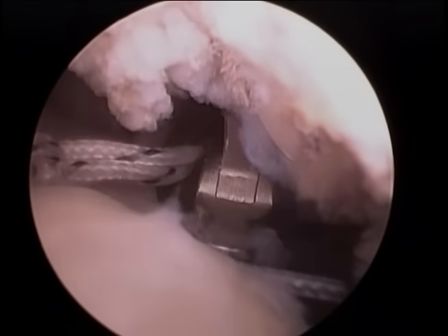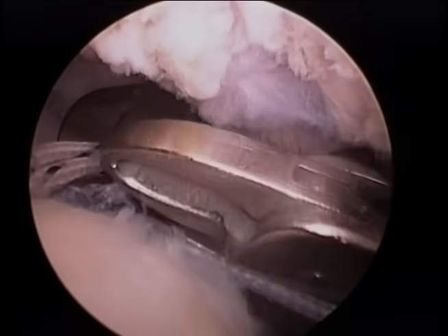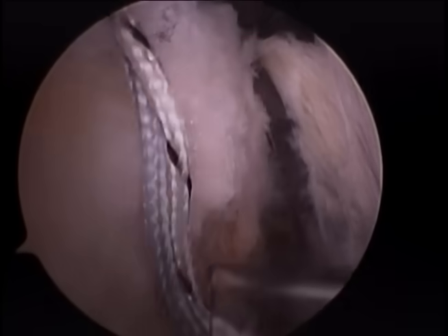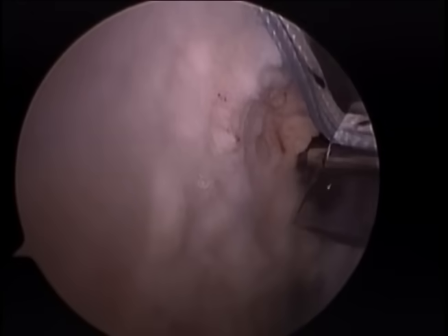We next prepare for our lateral anchors. We need one of each suture, one blue and one white. Thus, we retrieve these to load outside the body into our push-lock anchors, which, as you will see, will firmly pull the tendon down over the footprint of the greater tuberosity. We seat these anchors in the good lateral bone of the greater tuberosity.